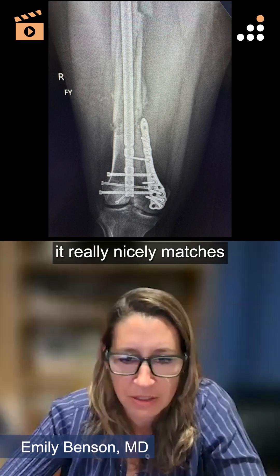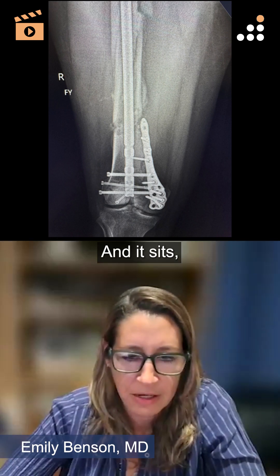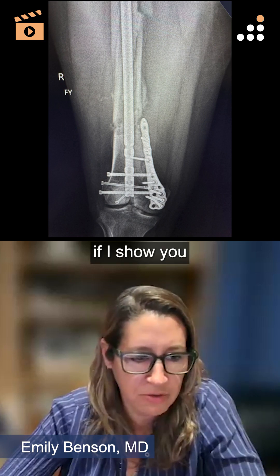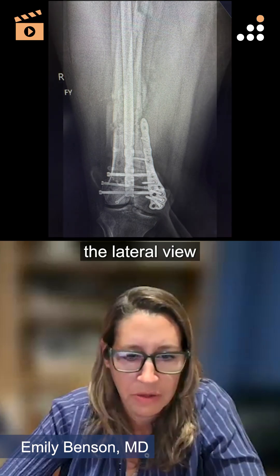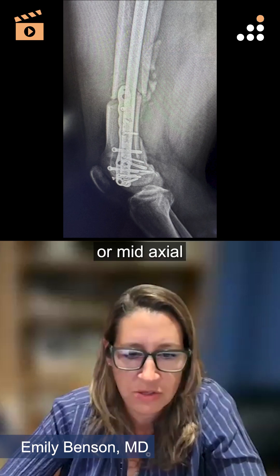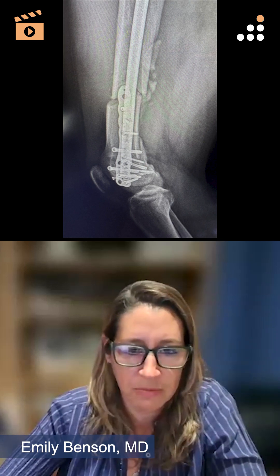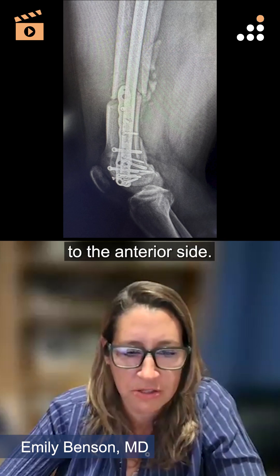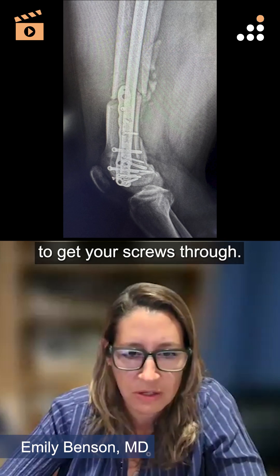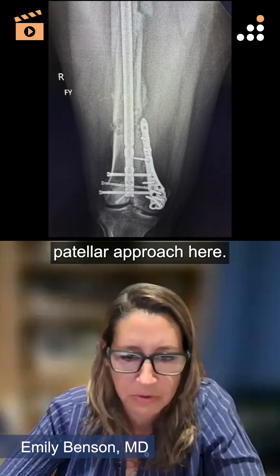You can see that it really nicely matches the contour of the medial distal femur. And it sits, if I show you the lateral view, kind of midline or mid-axial with a little bit of extension to the anterior side. So it's very easy to get your screws through a medial parapatellar approach here.